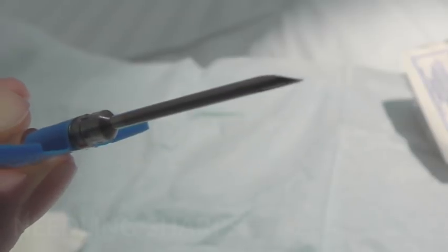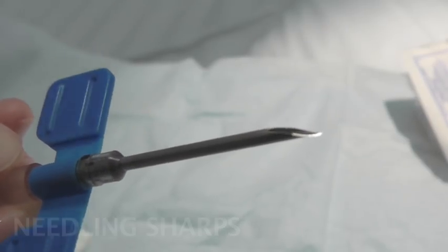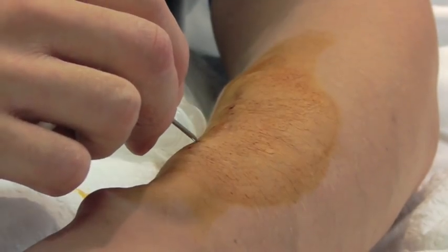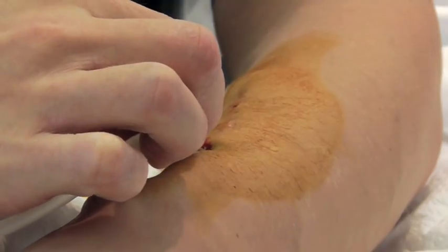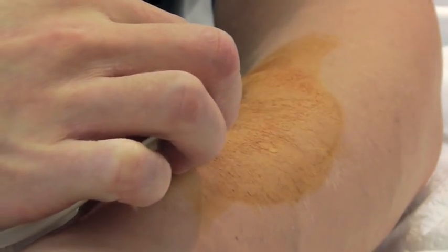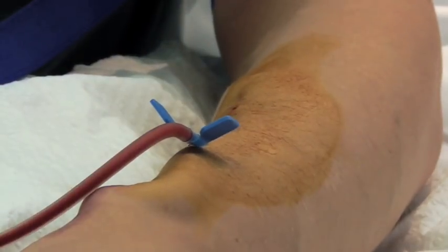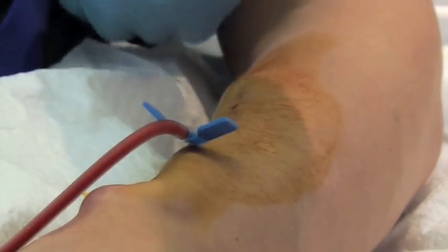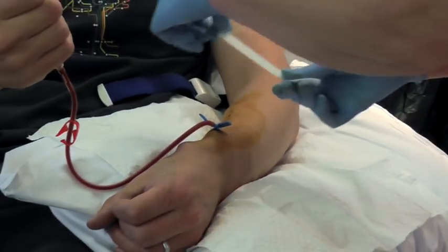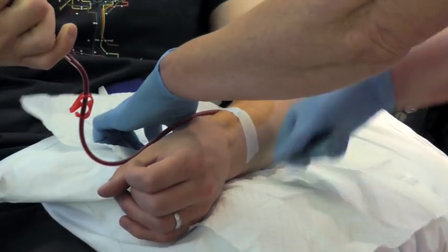The two patients on this film are both needling themselves under my supervision. They've found good places to needle and are introducing sharp needles into the same tract as before. We find that if patients needle themselves then they needle at a good angle and make a good tract that they can easily use themselves. If the patient can't self-needle then you should use the same member of staff to form the buttonhole tract.